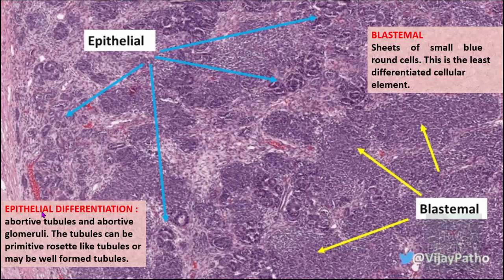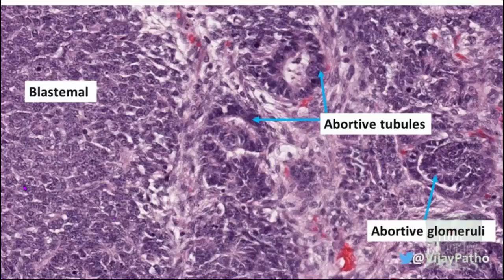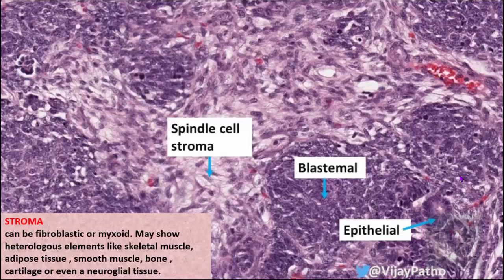The second component is the epithelial component, which shows epithelial differentiation in the form of abortive tubules and abortive glomeruli. These tubule-like structures are formed by tumor cells but are not true tubules because they lack a basement membrane. Similarly, abortive glomeruli are not true glomeruli — they are tumor cells arranged in a glomerulus-like pattern without true capillaries.